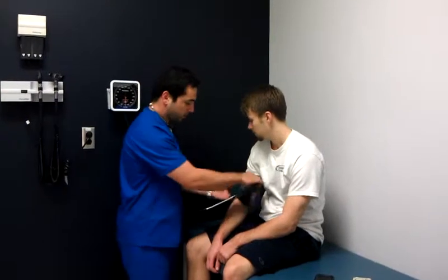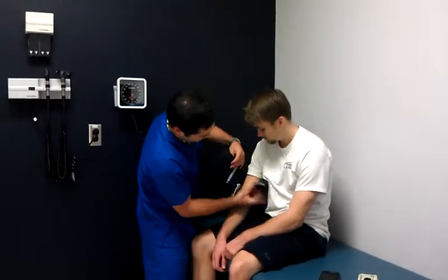We're going to be taking height and weight soon, so I would ask the patient to momentarily take his shoes and socks off for an accurate measurement. It's about time to assess you for your blood pressure. So, administer the cuff, apply it around again.